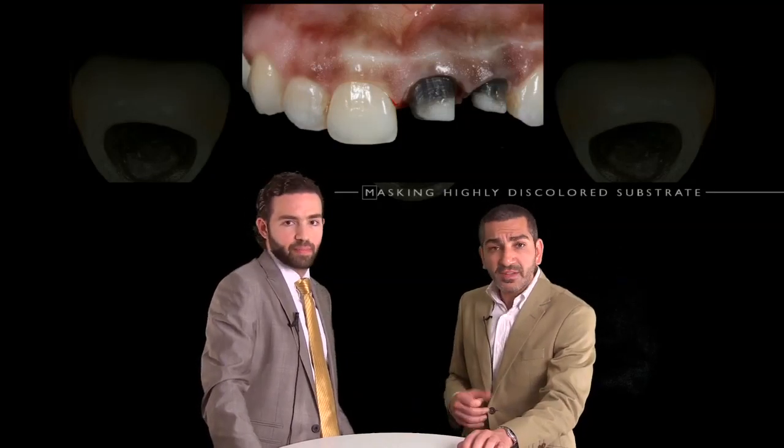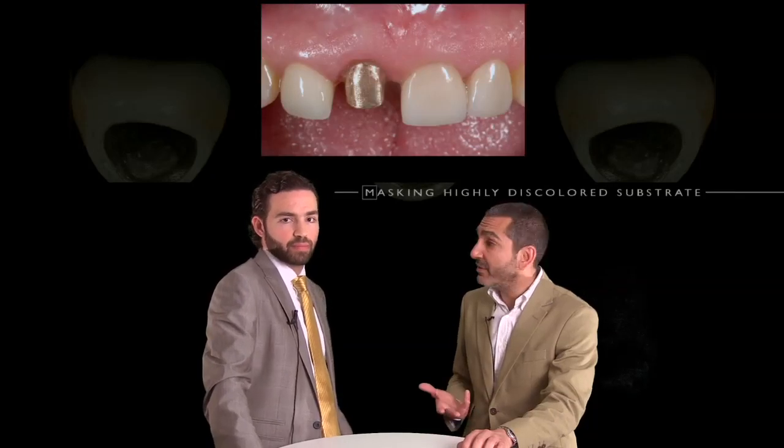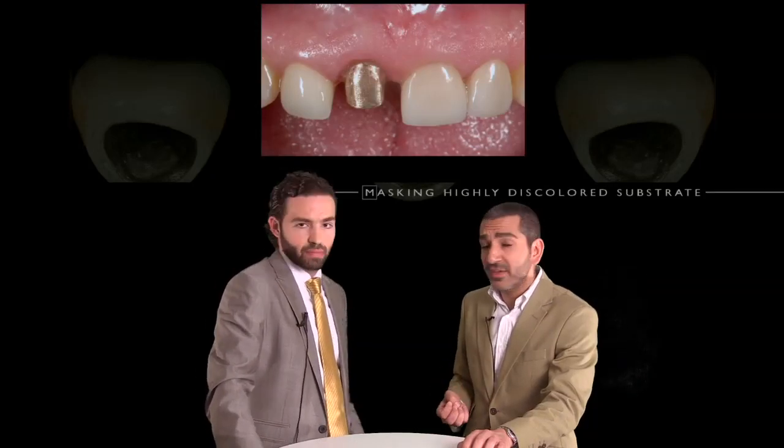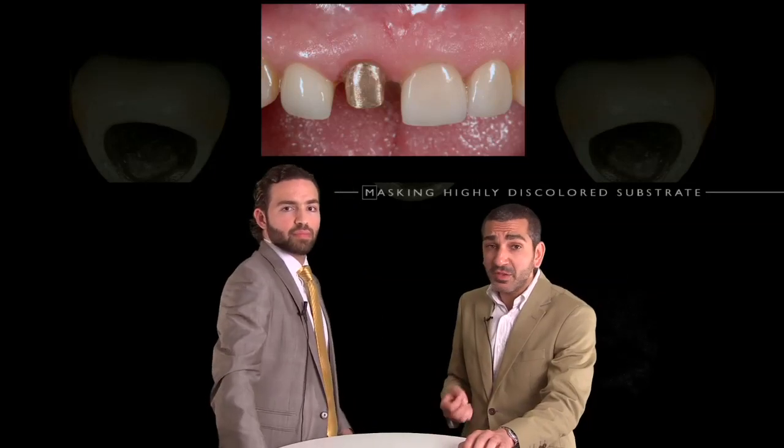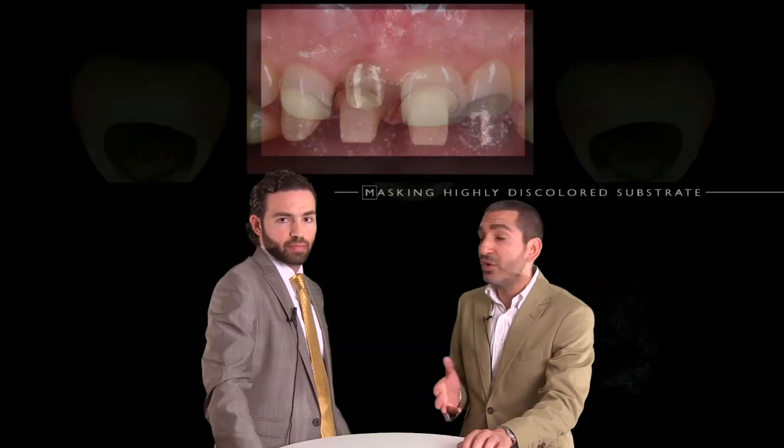Absolutely. Let's take a look at another situation. Here, this post cannot be retrieved. The only way we can restore this effectively and simply without too much headache is with a porcelain fused to metal crown. Again, no debate.